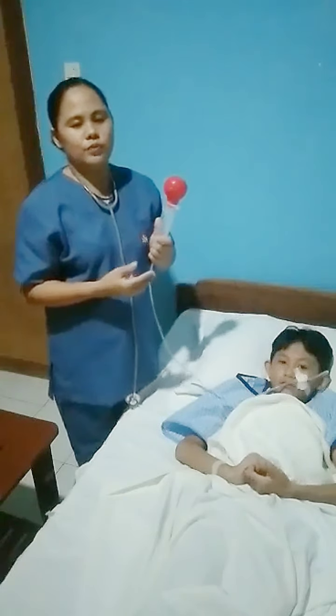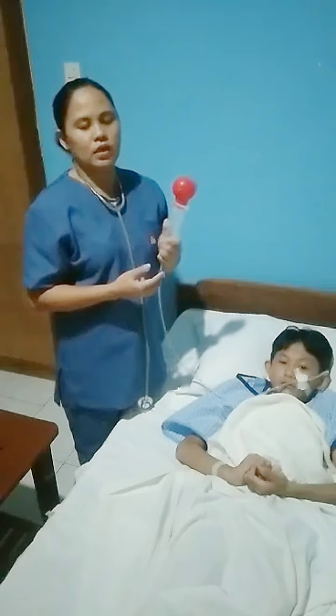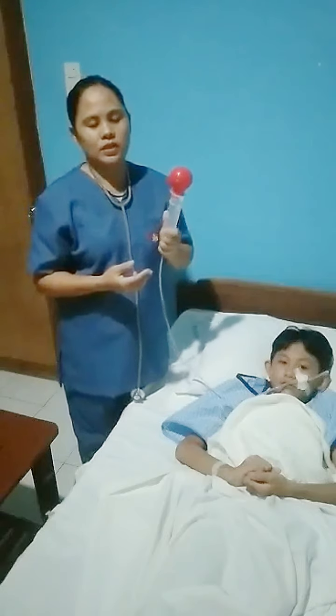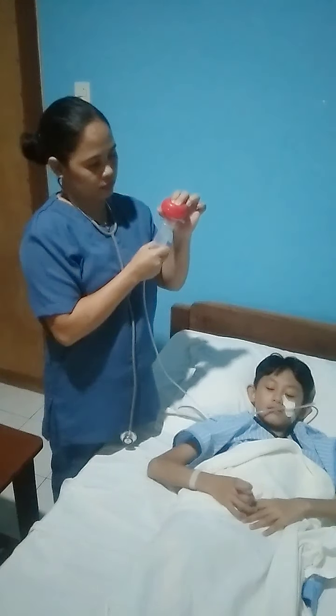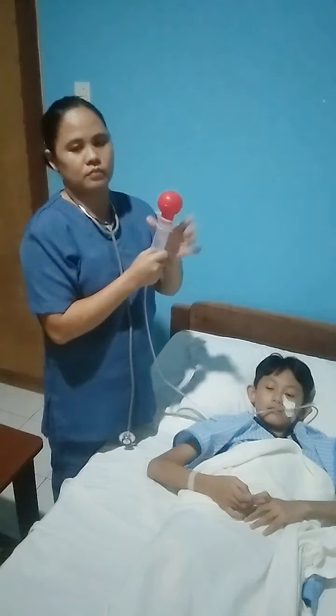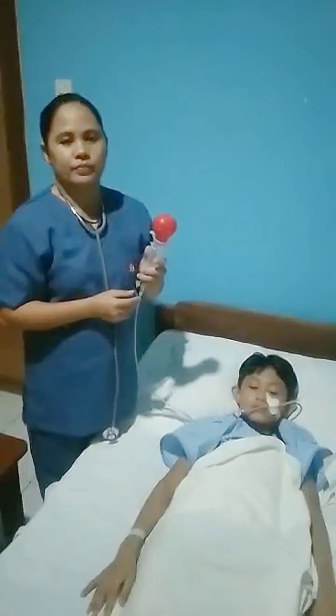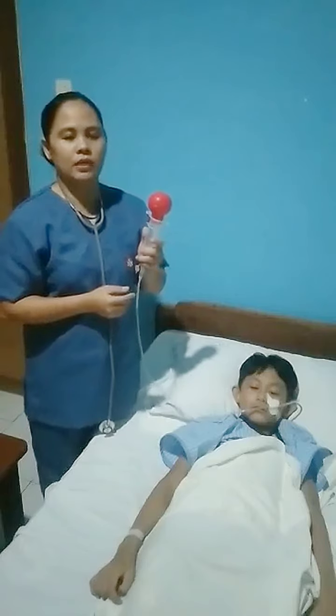After that, we have to put the residual volume back by pushing slowly with the syringe. Put it back by pushing it gently or slowly. After putting back the residual volume, we have to flush 10 ml of water.